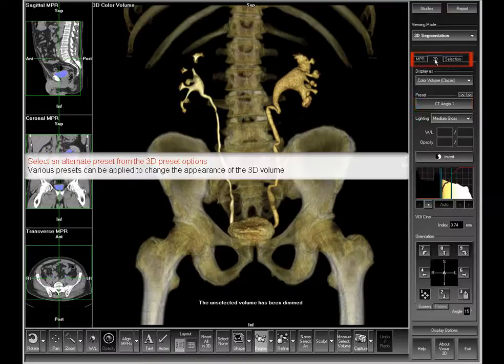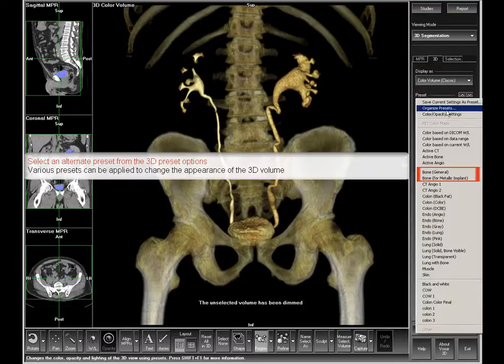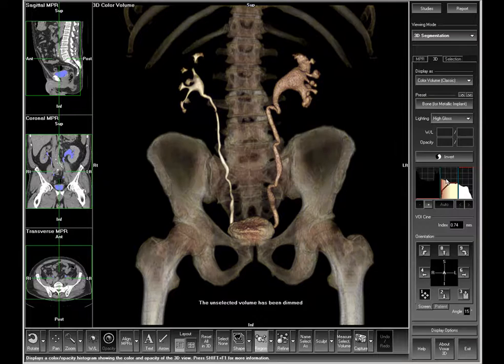Select an alternative preset from the preset options. You might want to try one of the bone presets.